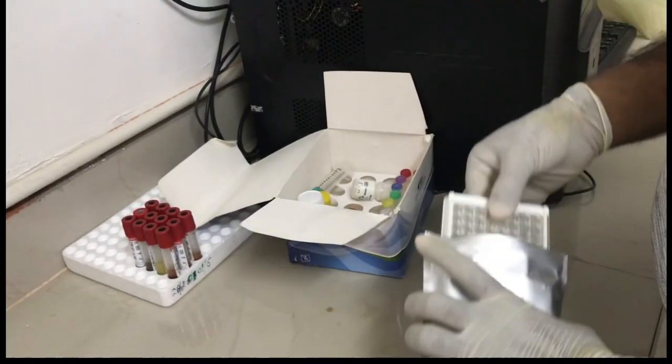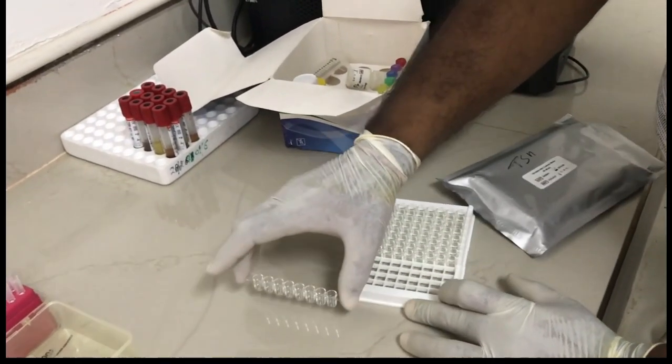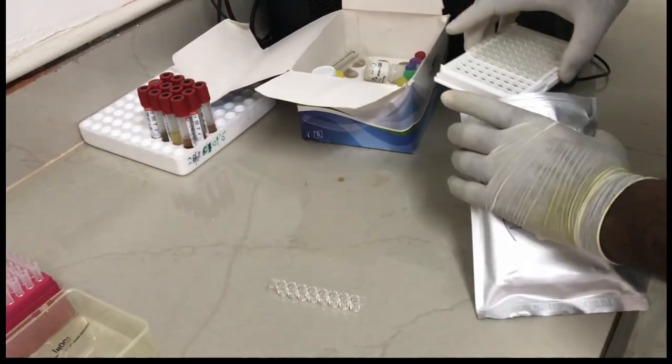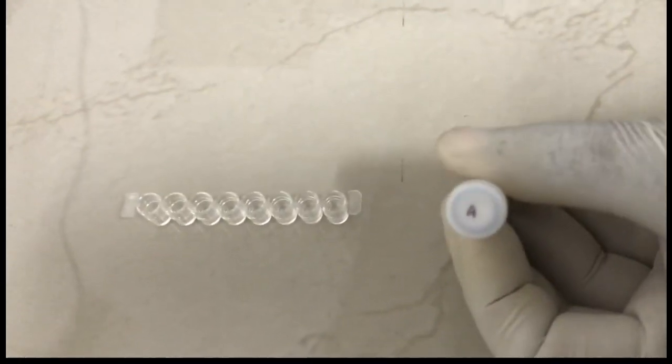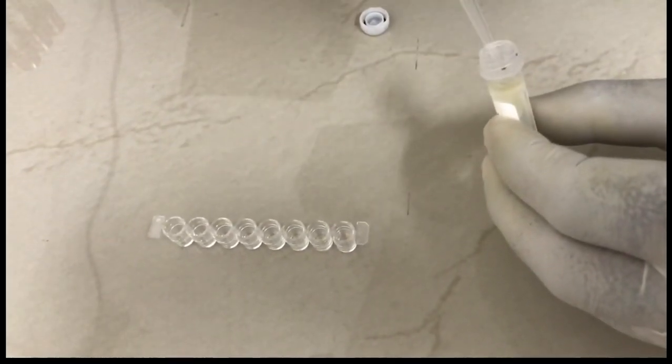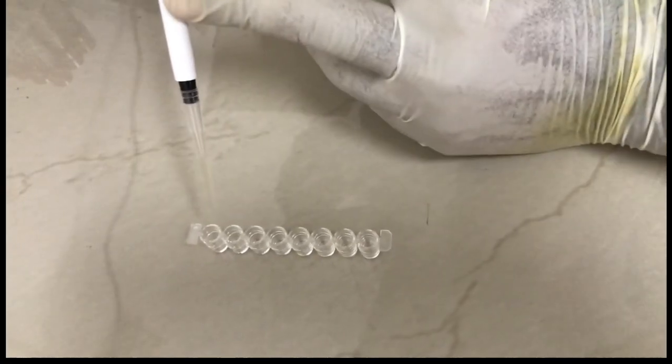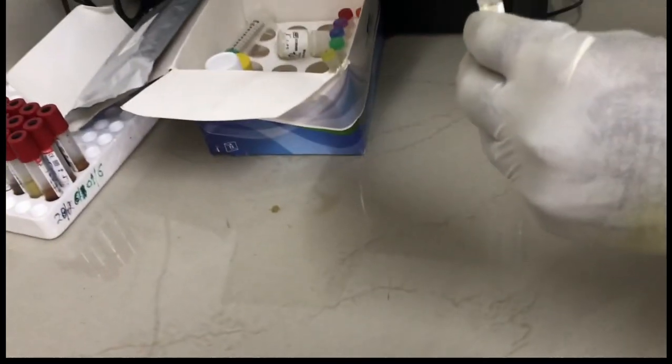Now we are starting the first step of our TSH diagnosis. Here we have taken out the 96 well coated strip, in which the wells are already coated with TSH antibodies. We have taken out 8 wells. These are the 8 wells in which the test will be done. We will be taking 5 controls and the rest 3 wells will be taken for sample testing. This is control A, which we are taking first. 50 microliters of this control A will be put into the first well.